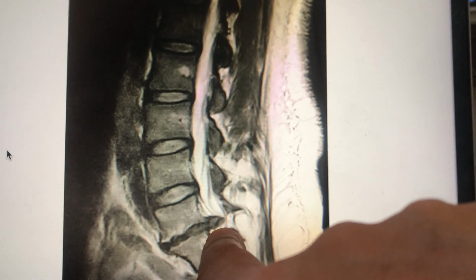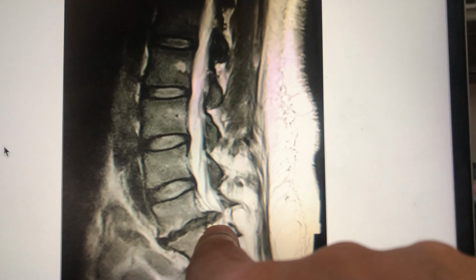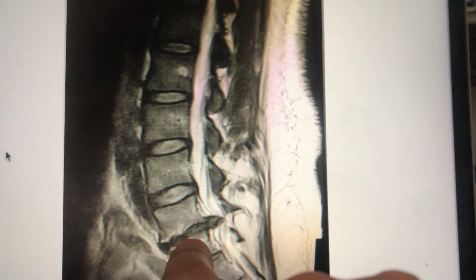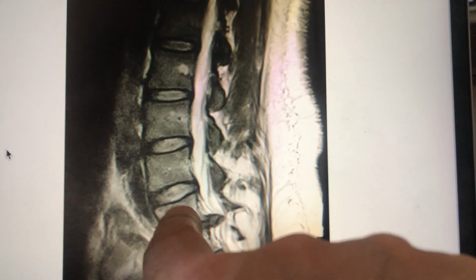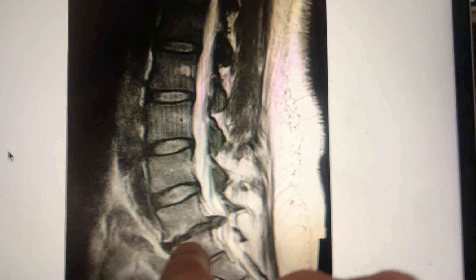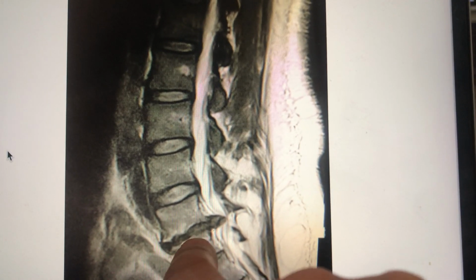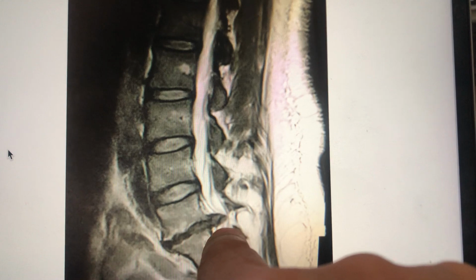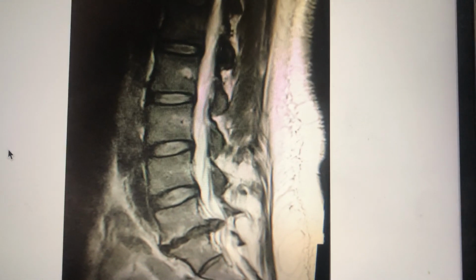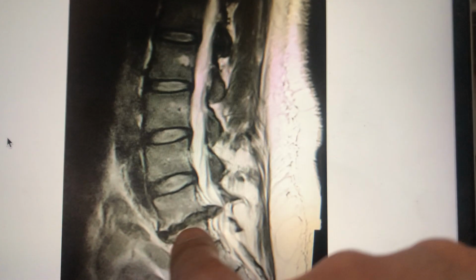When the disc contents herniate out like this, there's less content back here in the disc where it originated from. That means that the spine and the vertebra collapses on the one beneath, and you can see that this is a very thin collapsed disc as a result. This patient has had significant pain and sciatica for 4 months. That's not a long time.